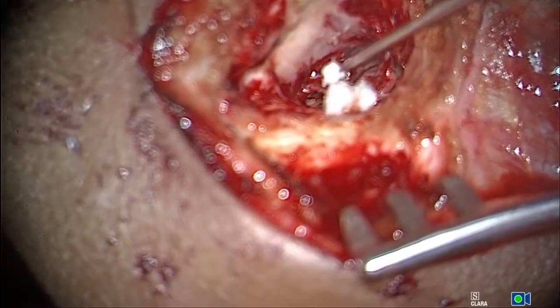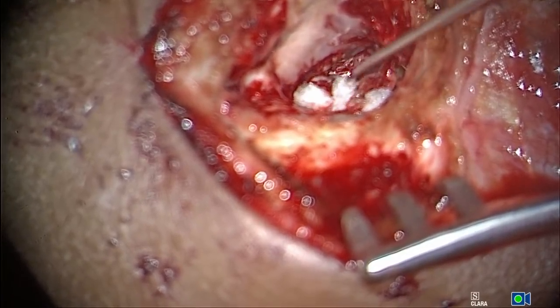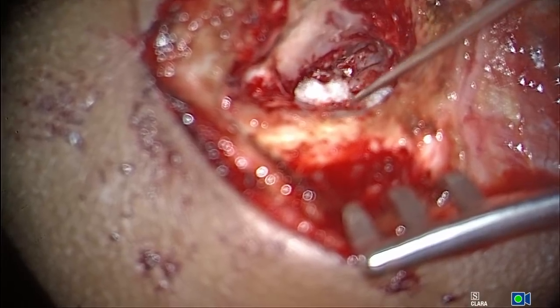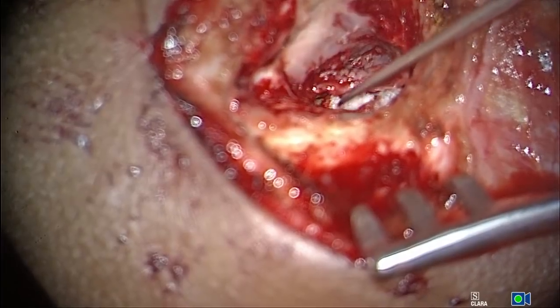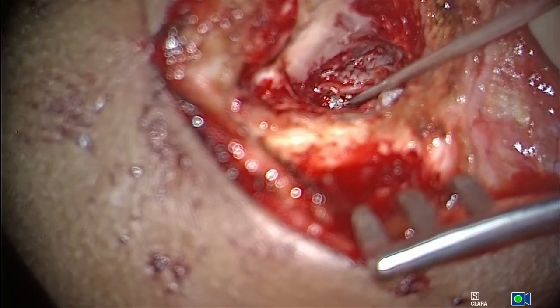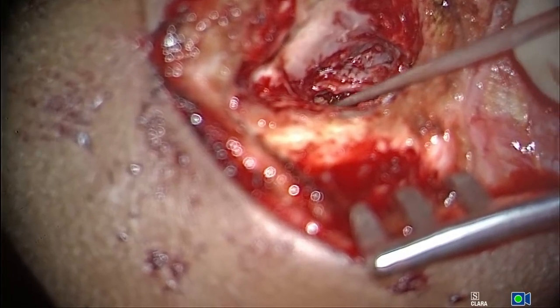Yeah, I do both. Basically, you have to create a suture line. So it is better to keep it underneath the malleus, or make a slit in the graft and double breast the graft. That is a better technique, double breasting the graft.